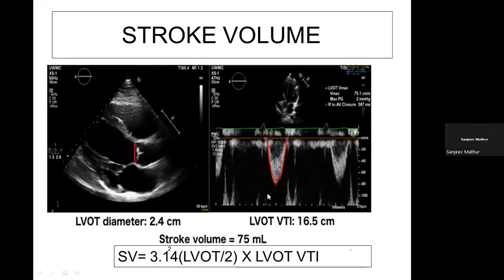AI-based softwares, yes. The only problem with the AI-based ejection fraction is the imaging quality has to be excellent. If you look at echoes, only 40-45% ejection fraction would be calculated perfectly by AI-based ejection fractions. They claim about 90 to 95% efficacy, based on proper imaging quality. Try this tomorrow, because if you don't give them good imaging quality, they'll not give you a good ejection fraction. Whatever they claim is based on the demonstration models, not on routine examination models.